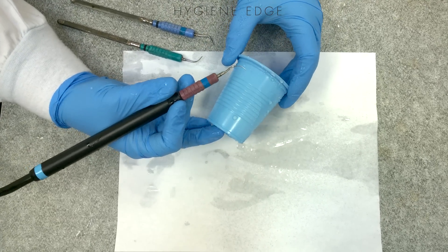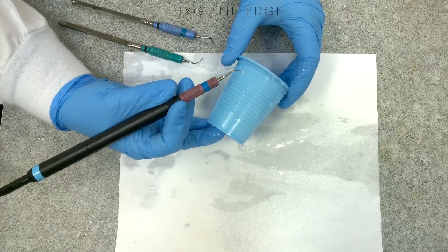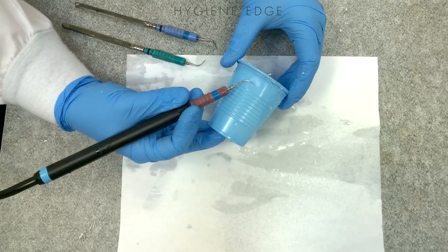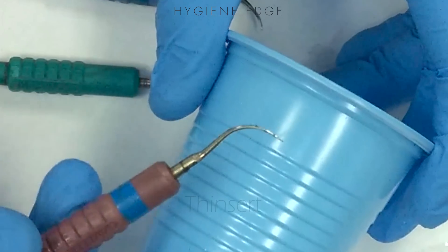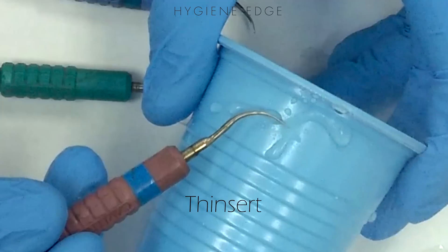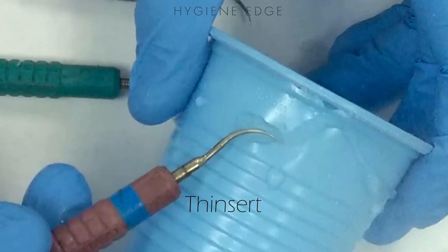But if you don't have that handy — if you're in the middle of an SRP and it's not working — you can test your ultrasonic tip on the side of a cup to see if it's still effective. Just activate the tip and use the last tip third, like you normally would, against the cup, and it should make a little hole in it.